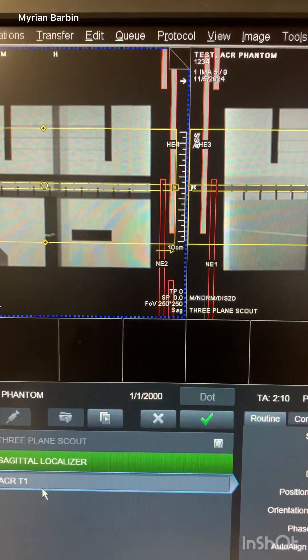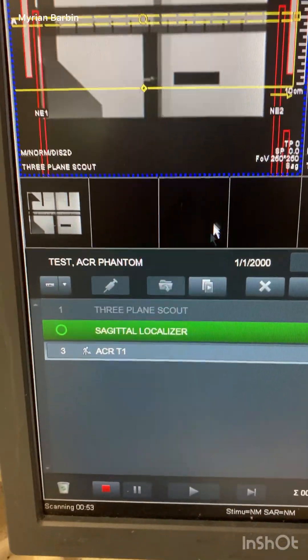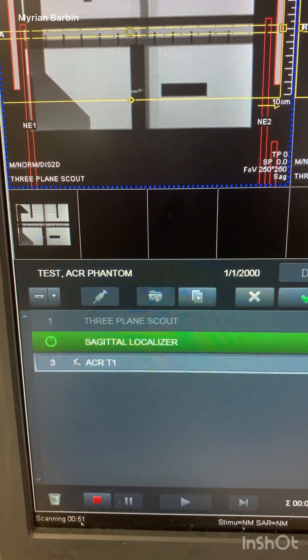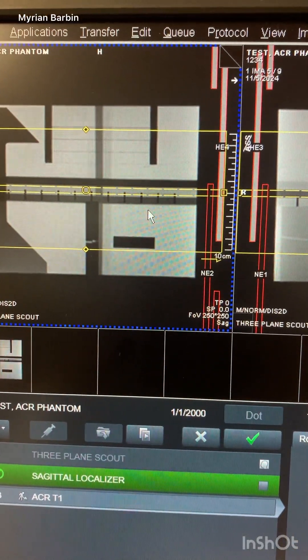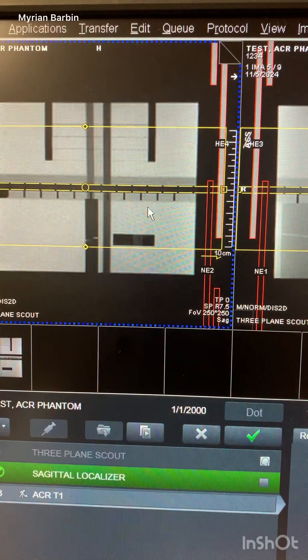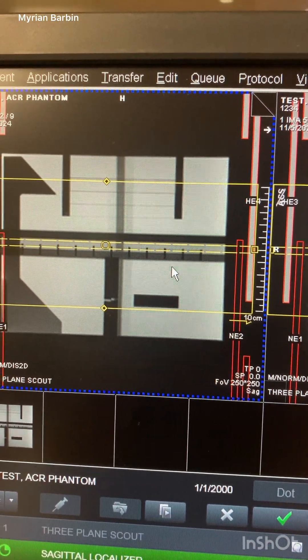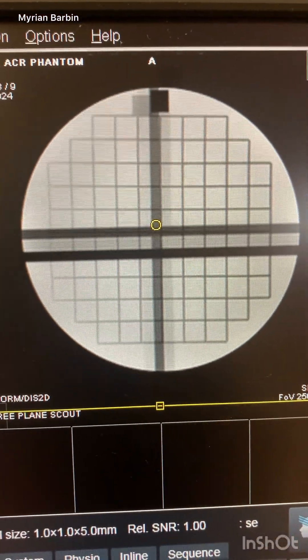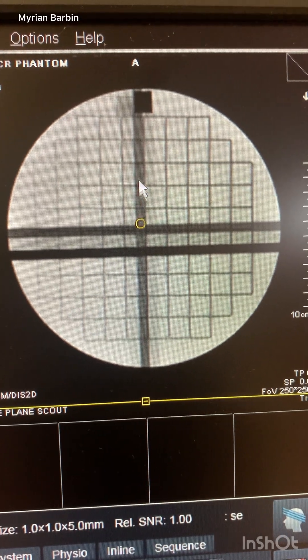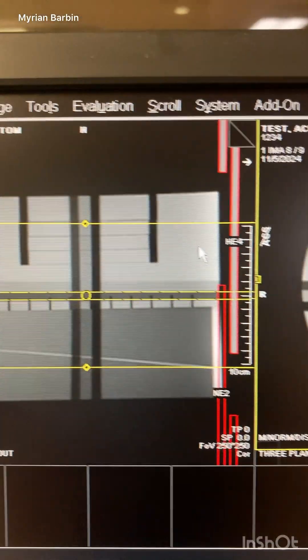After that, the ACR T1 will run — this one is going to take about 50 more seconds. Before you start, you want to make sure that you have the phantom aligned perfectly and leveled out correctly, because if not, the phantom pictures will come out twisted or angled.